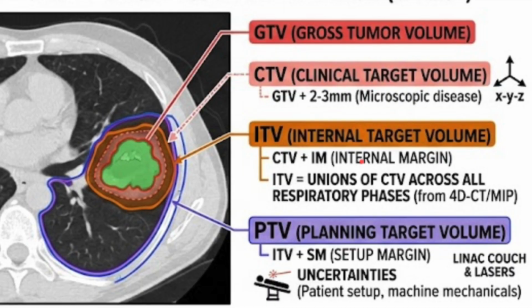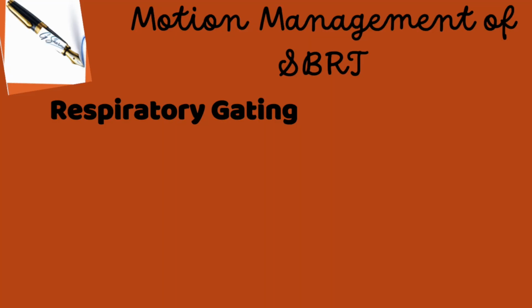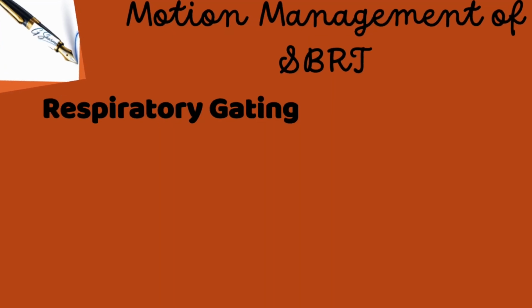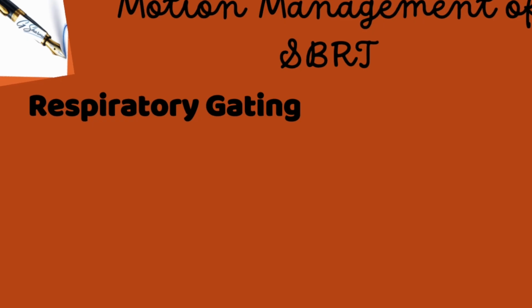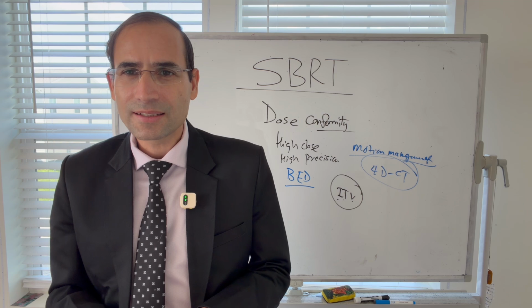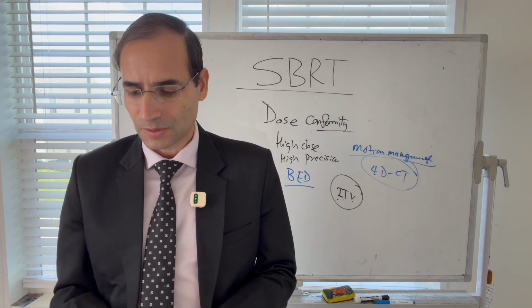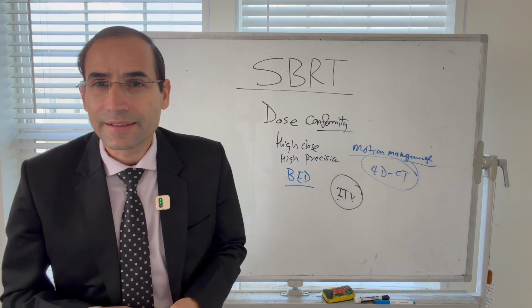Okay, so we can also use respiratory gating. That is another technique we can use, where the radiation is delivered only at a certain phase of breathing. You deliver the radiation while maybe inhaling or exhaling. That we call respiratory gating.